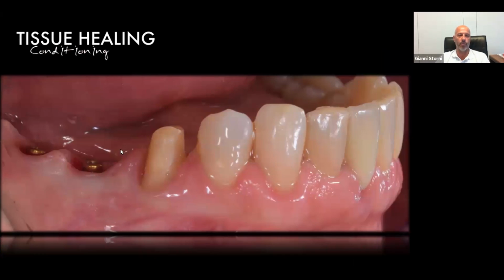Yes, for example, what is very important as a message that Emiliano also already told you is that, if you like the solution, you may have 2, 3, 4, 5, 6, 7 doctors, if you are a technician, that are using different platforms. You always come out with the Equator, and you always come out with one abutment. So you don't need a lot of components.